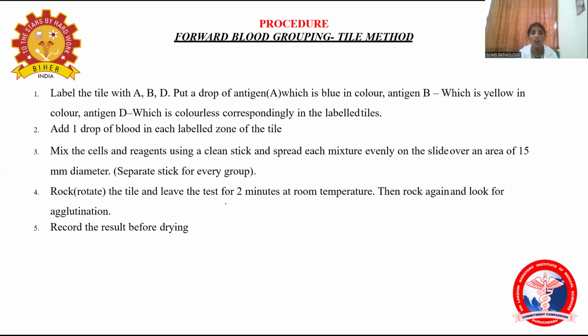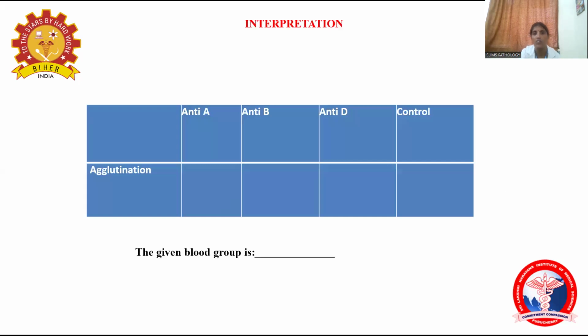So now rock or rotate the tile. Just mixing is not enough, you rotate the tile like this, and leave the test for 2 minutes. Here it is given as 2 minutes, but it's not exactly 2 minutes as given in our textbooks. But for a minute or so, when you do all these steps properly, rock again and look for agglutination. Now record the result before drying. This is how you have to interpret.